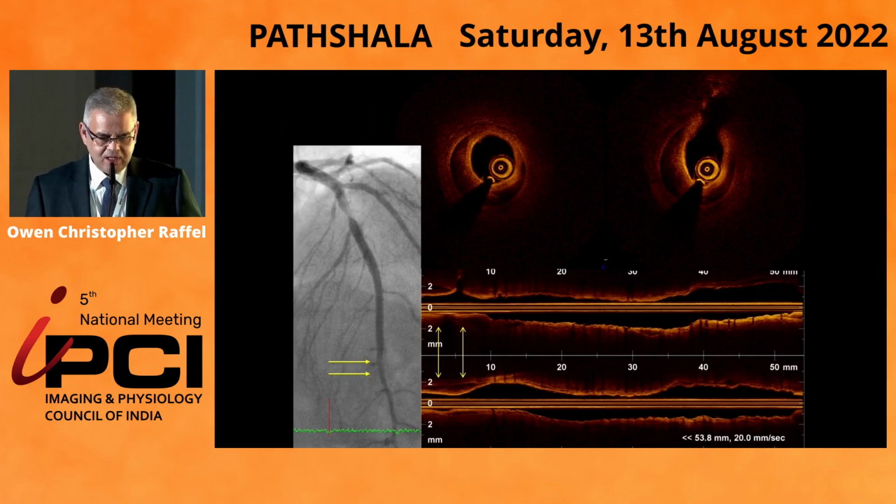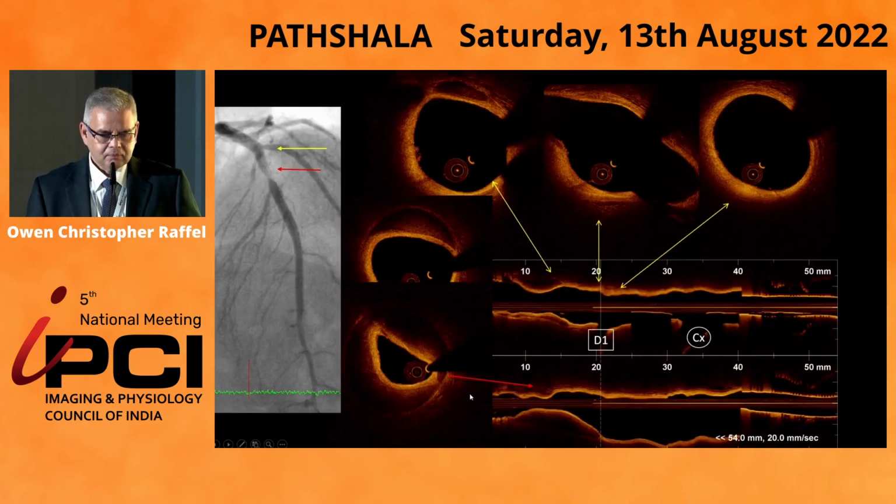This is the OCT, that's distal to the stent, very clearly that's SCAD. Proximal to the stent, that's here, you can see now propagation of the hematoma and compression of the lumen with SCAD, which even goes up proximally beyond the diagonal.